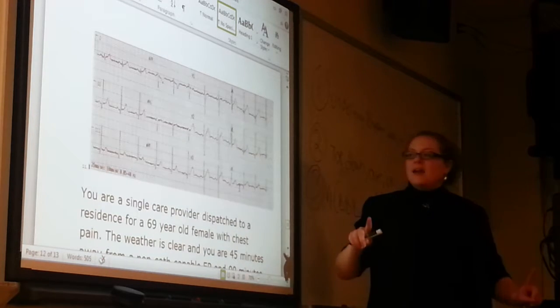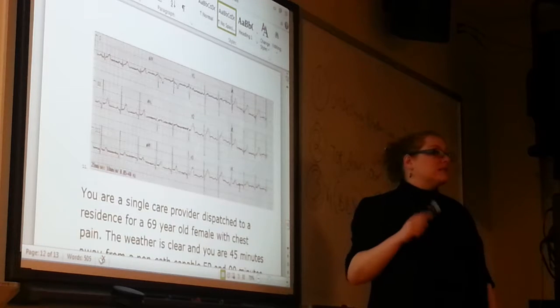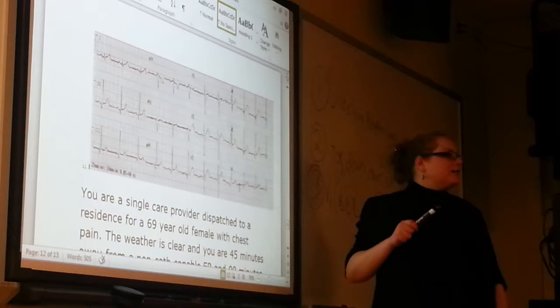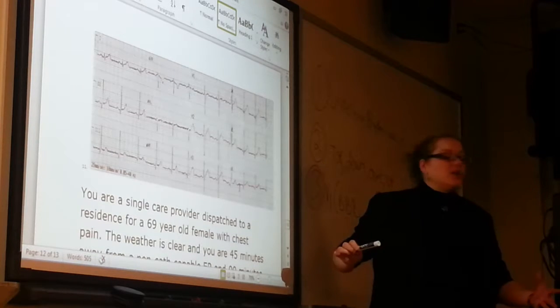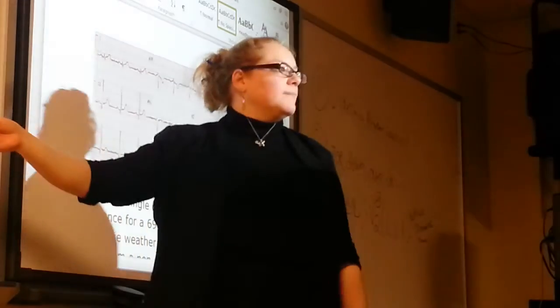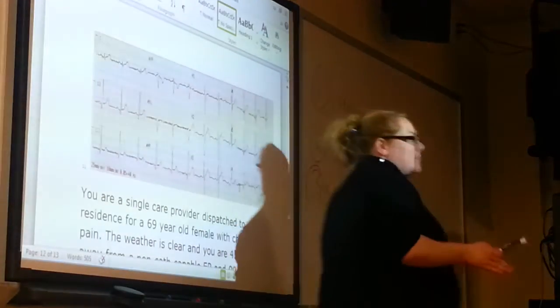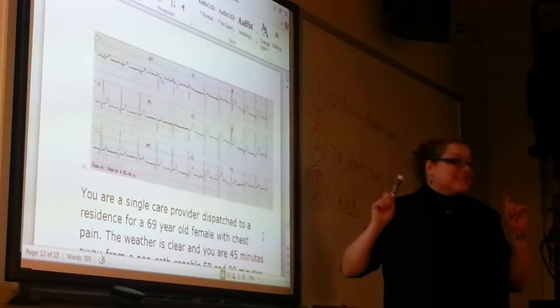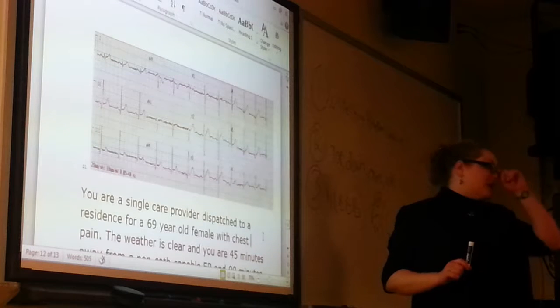I don't see anything that's isoelectric, or ST segment elevation, because I have a really bad isoelectric line. In a situation like this, our next step is to see if there's an issue in a contiguous lead. Contiguous in this instance would be V5 and V6, and I know that because I see all the leads. I may or may not have a problem in V5. If I have a problem in V6, now I know that I need to redo this, because there's a potential for an issue.